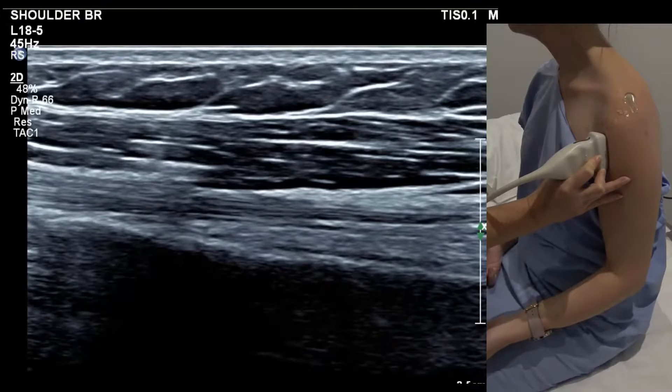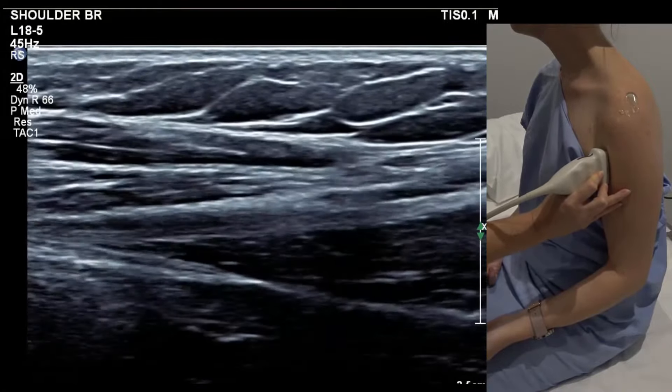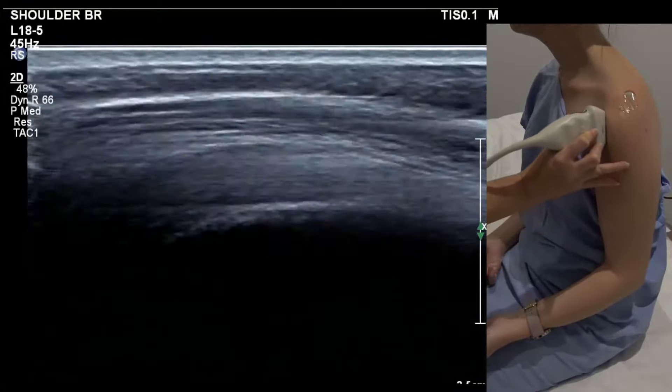We call it an effusion if the fluid is about the same thickness as the distal biceps. This is the little circumflex artery going around the humeral neck there. Come down into the muscular belly — that's the long head.